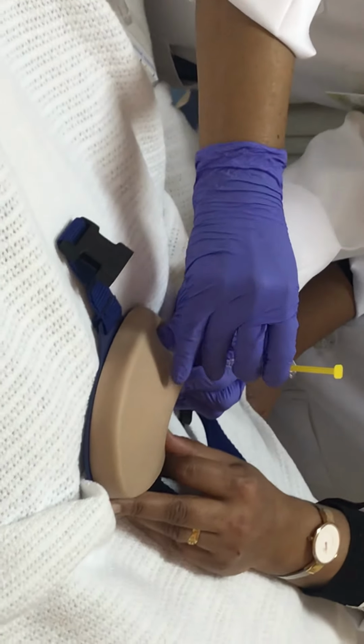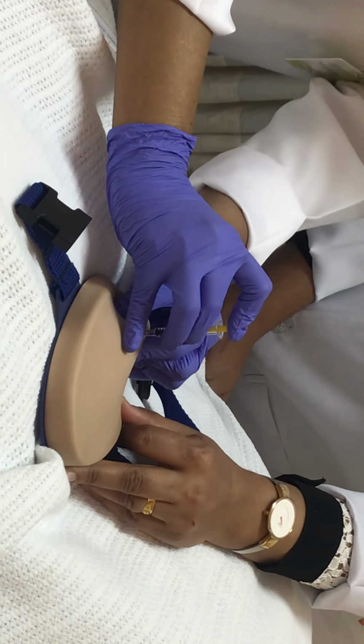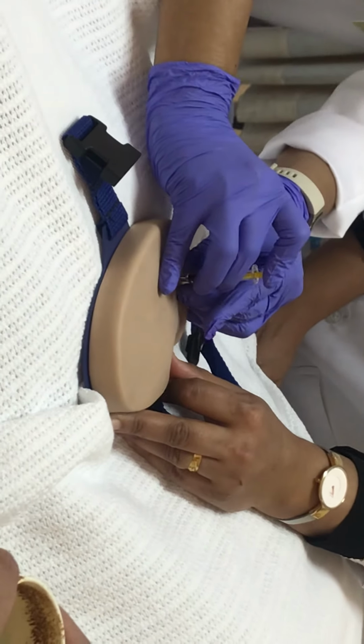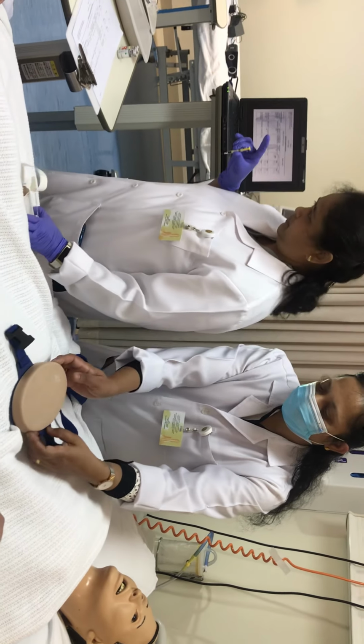Okay, so go inside, see my hand. I just push it with my hand. Continuously it should go. And the syringe also is not very long, so with my hand I can manage. Again, cotton should be kept and take it out. All the rest are the same. So throughout, this pinching should be maintained, and with the one hand technique you are going to give heparin. That is the difference.